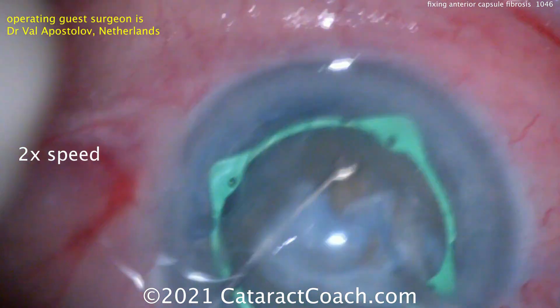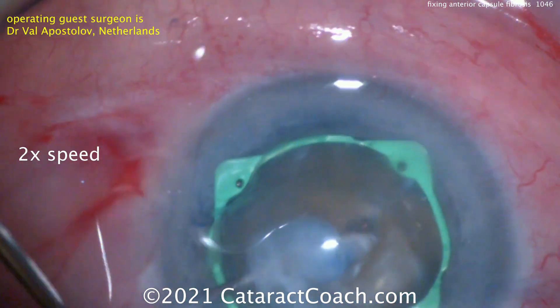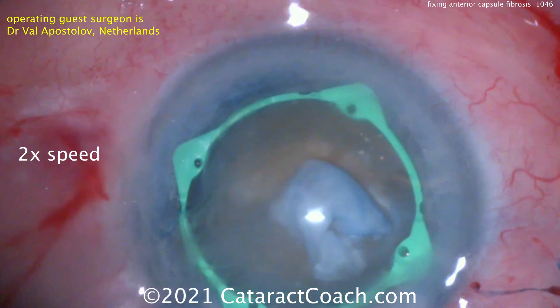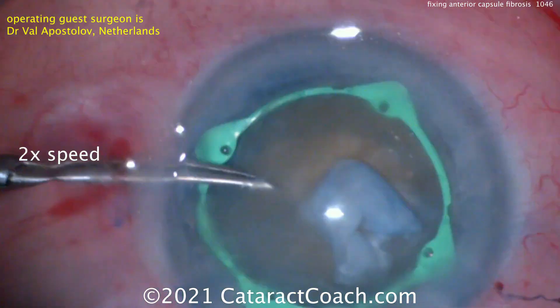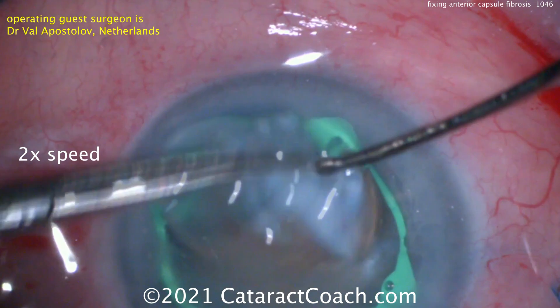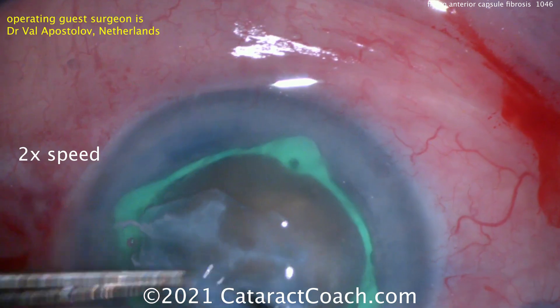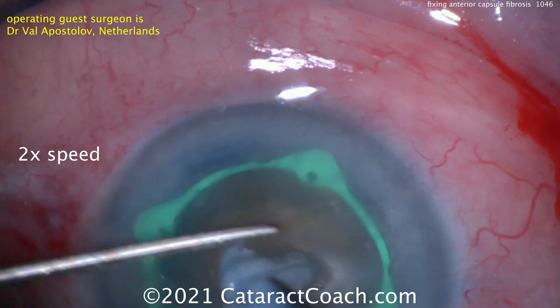It's no mistake that we've featured so many of Dr. Apostolov's videos here on CataractCoach — he's been featured many times and really has an innovative approach. Look how he separates all that fibrotic anterior cortex: that big whole membrane can now be removed from the eye, and the rest of the case is going to be pretty straightforward. That is not a little — that is a humongous thick fibrotic membrane that was the issue, and he handled it beautifully.